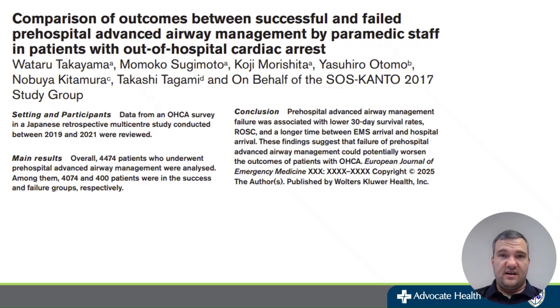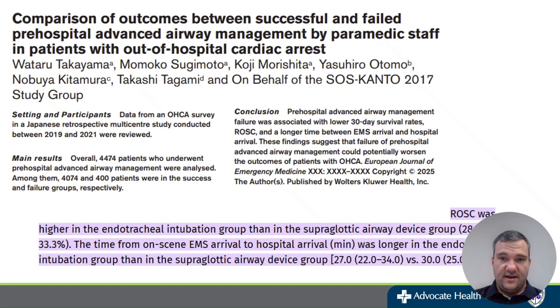This study is talking about slightly increased ROSC rates with ET tube intubation. It goes from about 28% up to 33% on patients that are intubated versus using a supraglottic device, which is highlighted down here. Obviously, the N number is pretty small in this study, but it does show a little bit of improvement, which is encouraging.